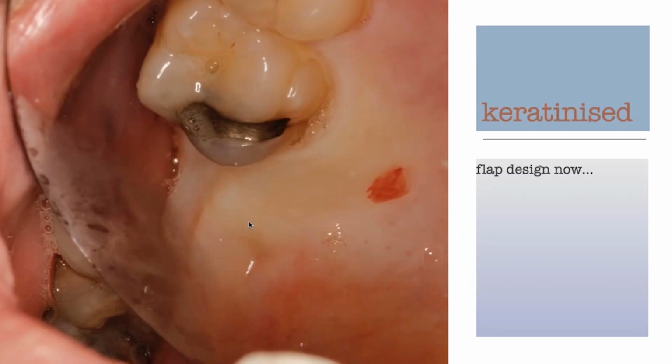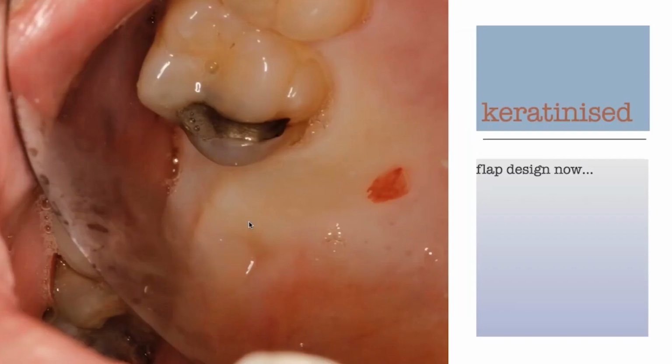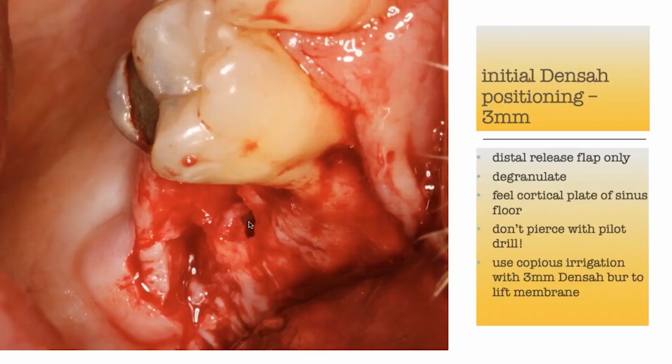So choosing my flap design here. Sorry for this photograph, it's using a mirror. Looking at the flap design again, the mesial part of the flap, I've not done a relieving incision there. Distal I have. A lot of degranulation required again.